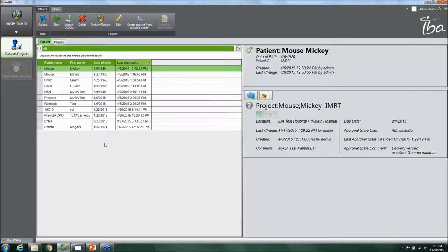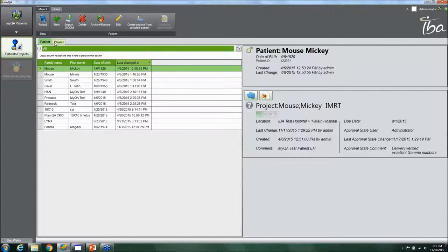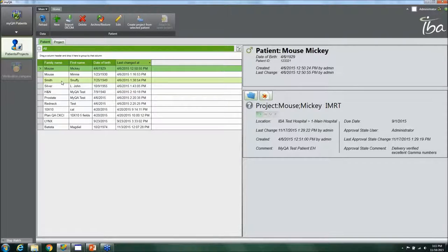Inside MyQA Patients, you have the patient column as well as the project column. The patient column contains a list of all the different patients you're treating right now and need to do pre-planned QA on. Projects are associated with patients because maybe a patient is getting treated for a second time or there's a different boost plan — you can create different projects for the same patient associated with the name.